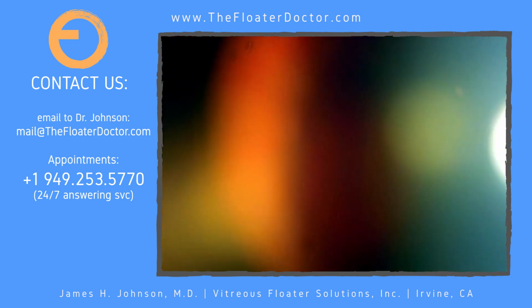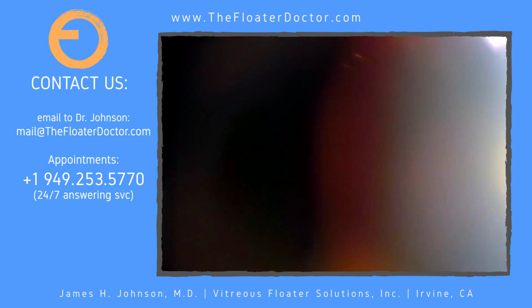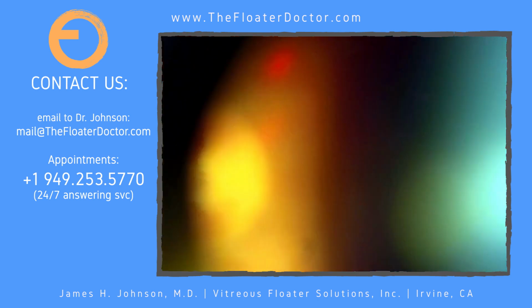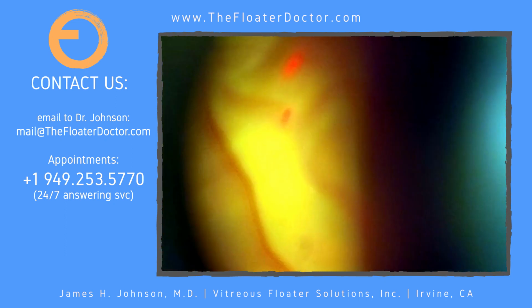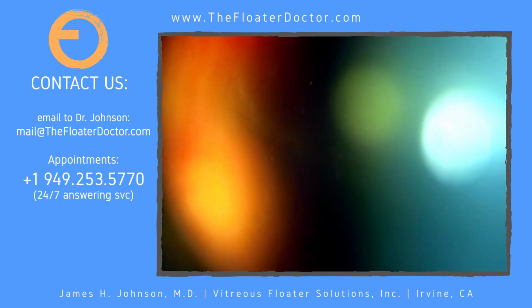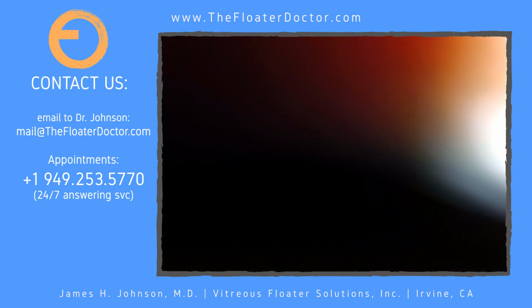You doing okay? Yeah, very good. Sometimes I forget there's a person attached to this eye. Gotta remember to ask. So I'm just chasing down fragments. Okay, look down. Back to light here.